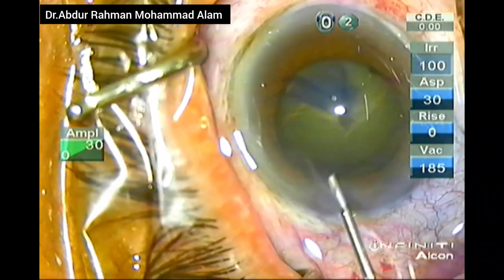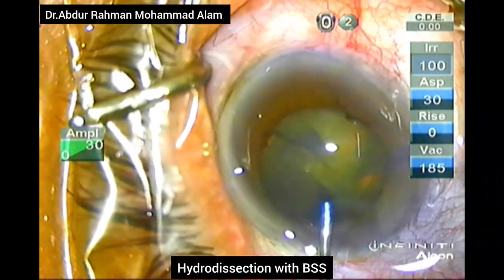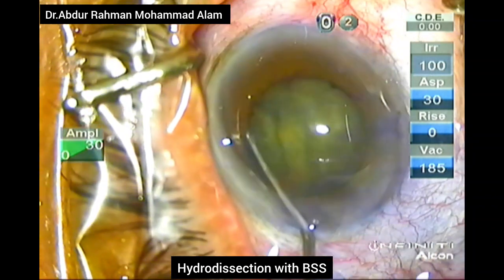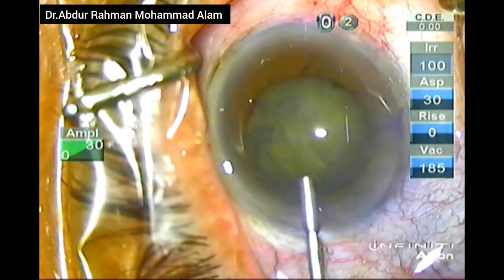My operation is being done under a peribulbar block. After the peribulbar block, there was significant proptosis of the eye. Hydrodissection is being performed followed by hydrodelineation.